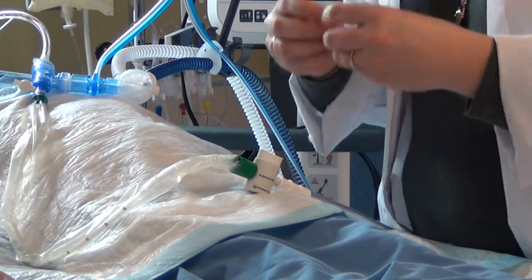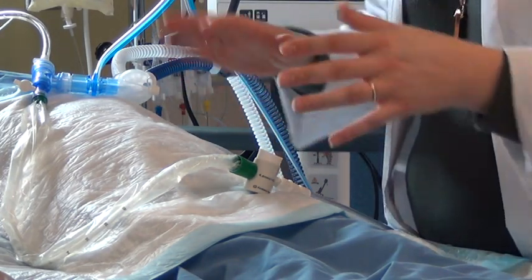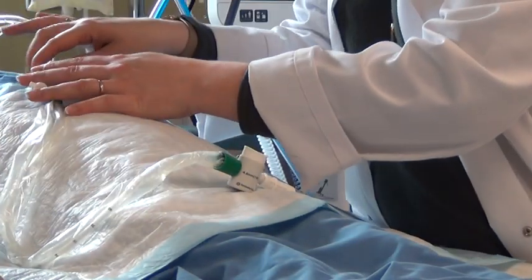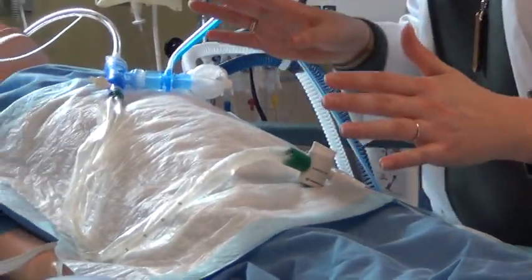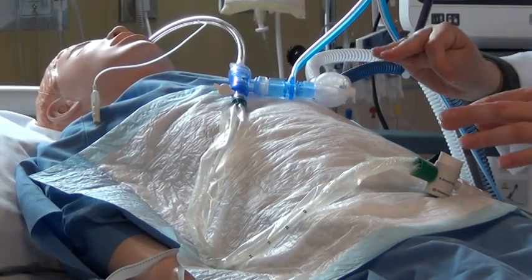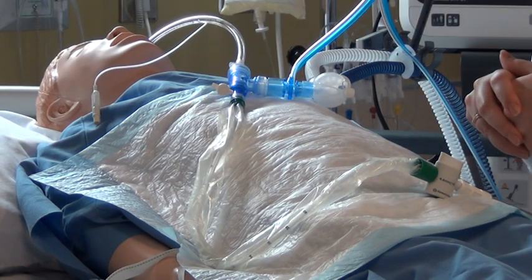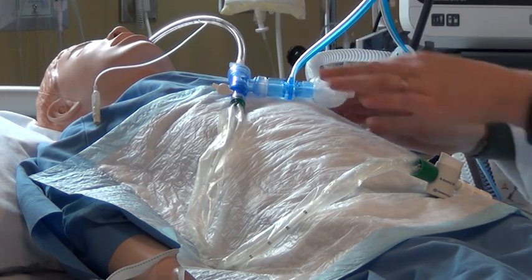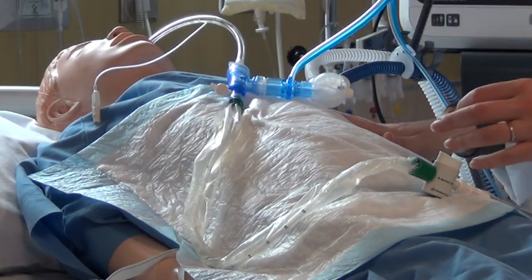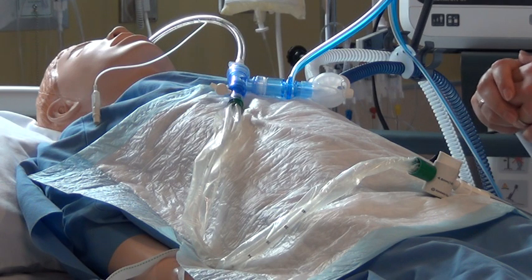We would open that suction catheter package, but we would want to make sure that we have a pad to absorb, because as we disconnect this entire assembly, there's a lot of condensed, humidified air here, and there might be some fluid that can splash back. So we want to make sure that we have something to cover the patient. We want to make sure that we have a face shield and a mask to ensure that we don't get anything in our face or in our eyes.